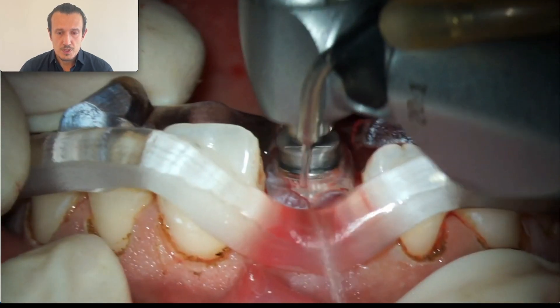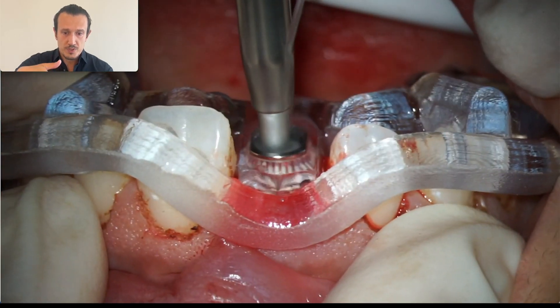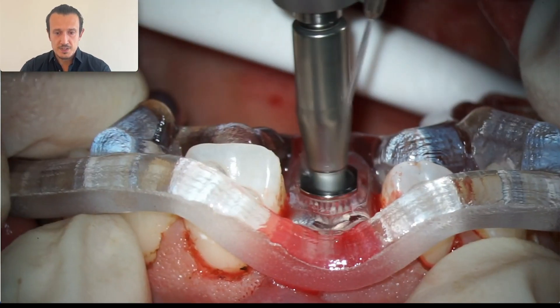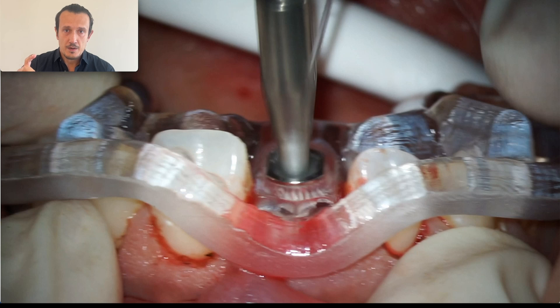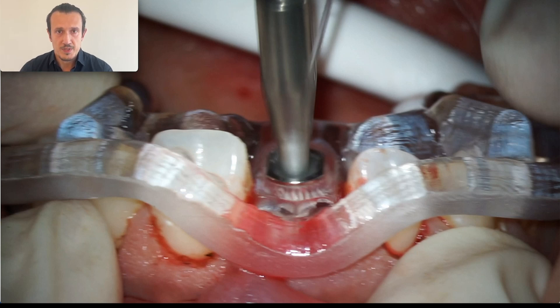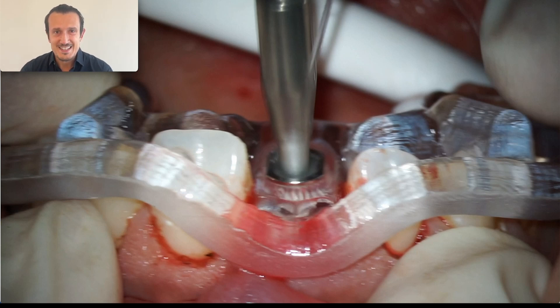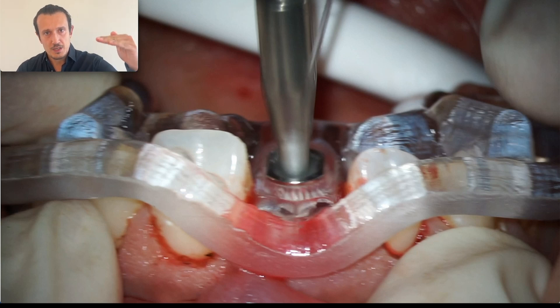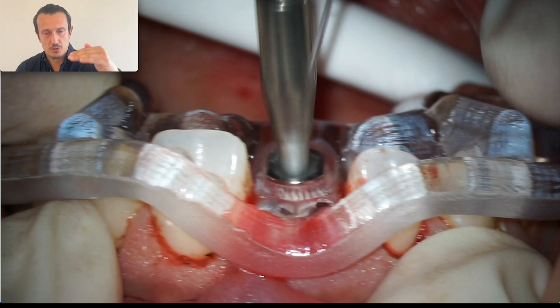Here I'm checking the position of the drills as I'm drilling: I make the first drill, then I look through the microscope to see if the osteotomy is going to the palate. This is something additional — not in the original protocol. I'm using the initial burr from the original set, not from the guided set, and going just a bit deeper because in this case it's very hard to plan the vertical position of the implant — we need to relate it not to the soft tissue margin but to the natural teeth.